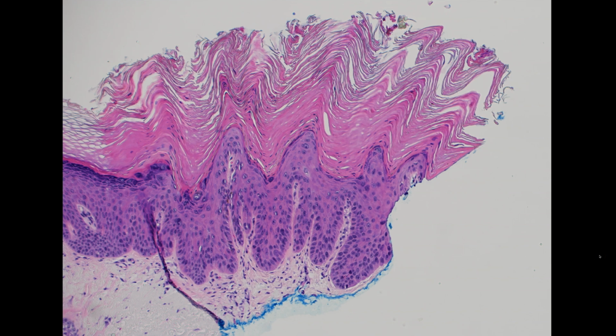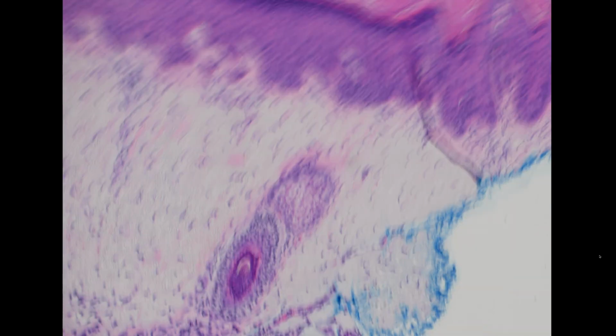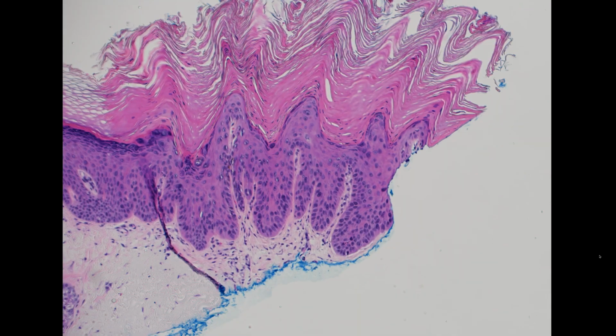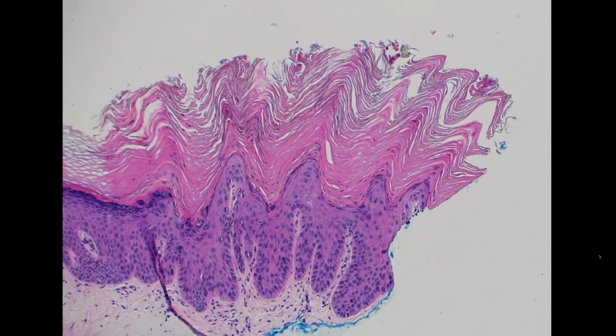Hi, I'm Dr. Jared Gardner, and I just wanted to share with you this cute little hypertrophic actinic keratosis. I thought it was a particularly photogenic example, and it's got keratinocytes that are atypical and jumbled down at the base. They're large compared to the smaller normal basal keratinocytes over at the side here, the normal skin next to it. And it's got a really cool kind of warty looking surface.